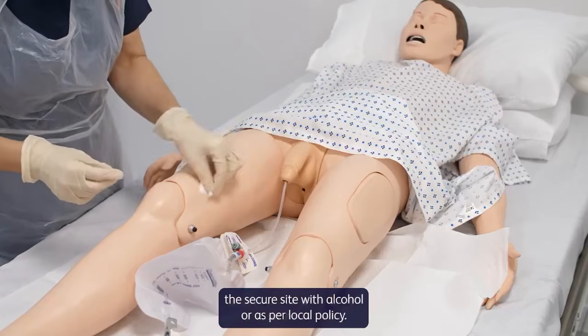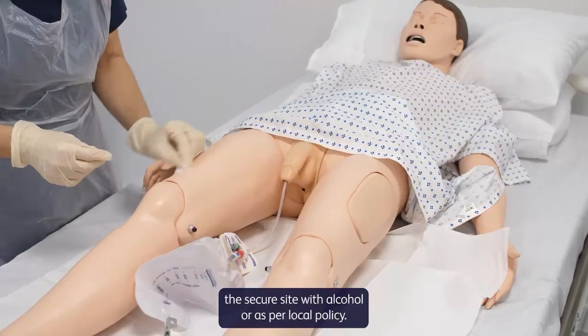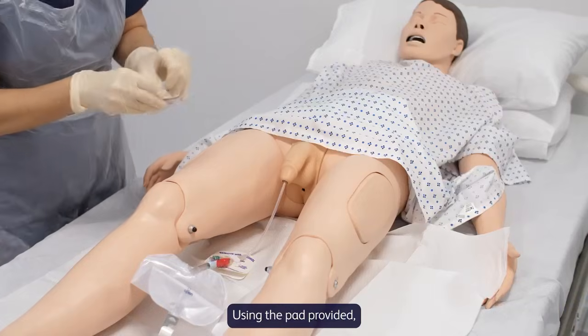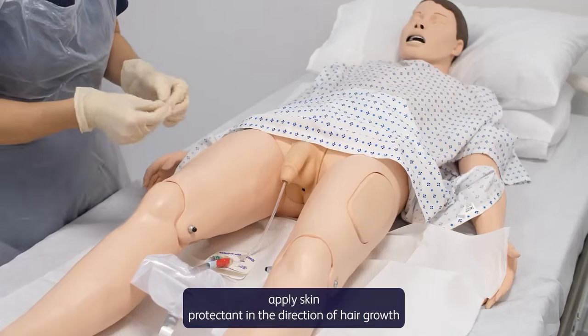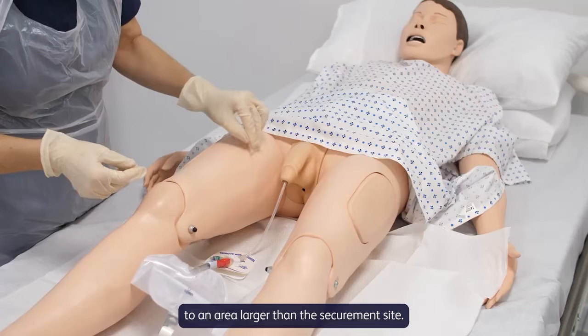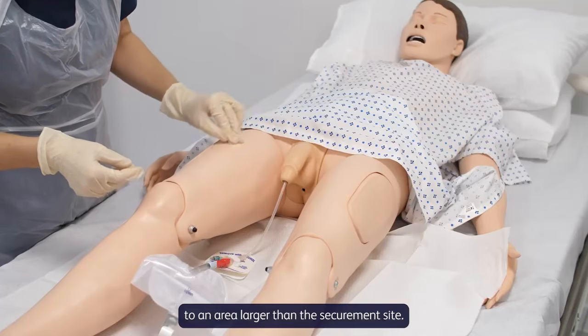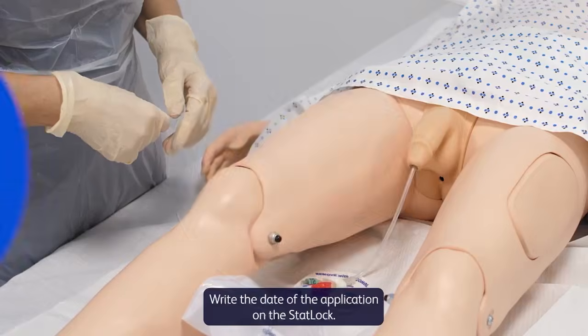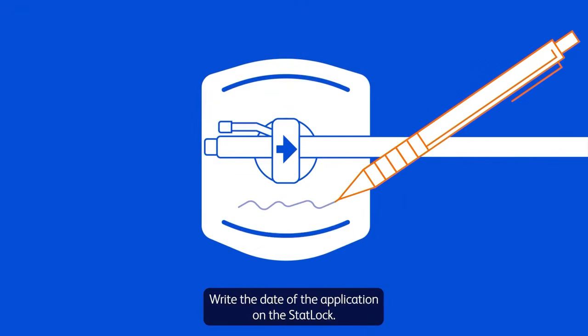Cleanse and degrease the securement site with alcohol, or as per local policy, let skin dry. Using the pad provided, apply skin protectant in the direction of hair growth to an area larger than the securement site. Allow to dry completely for 10 to 15 seconds. Write the date of the application on the StatLock.